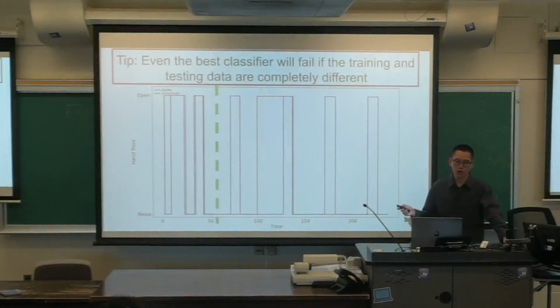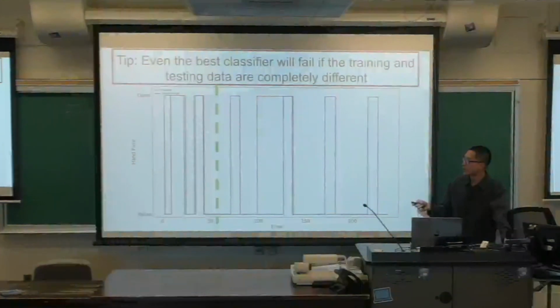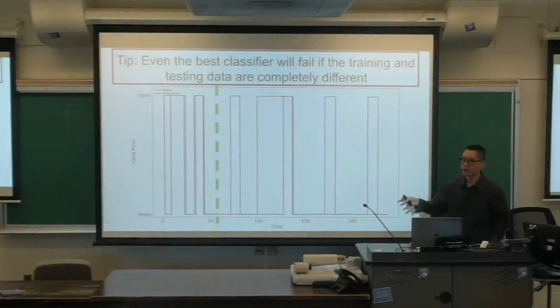And this is a quantitative visualization of the problem. It's trained on this condition, and the green dashed line indicates a change in condition. When the patient starts to move their arm, or the motor starts moving, you can see the algorithm fails drastically. And when the motor is engaged, it almost never works.